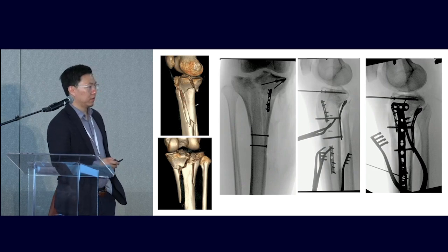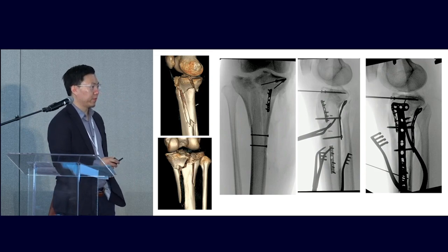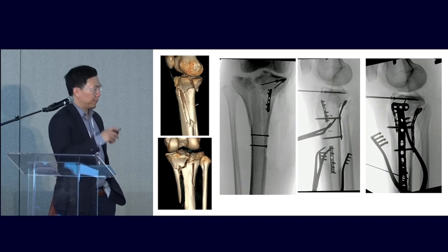No, the medial approach is fine, but you can go in here and do a submeniscal approach so you can see the whole thing, so I don't rely on fluoro as much. You can do exactly what you're doing, and then if you have the anterior approach as well, you lift it up and you can actually see it. I saw that you had your femoral distractor on it, and that's a good point. I saw the little ring, and that's critical because it opens it up. If you don't have it opened up, you can't see it. That's a good point.